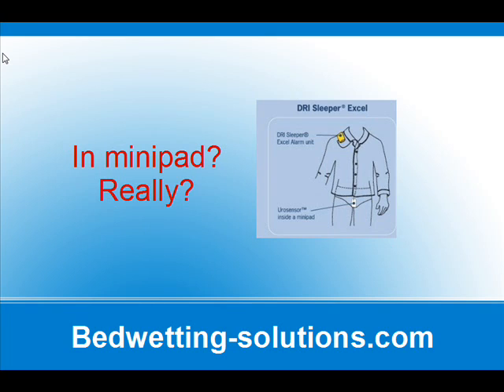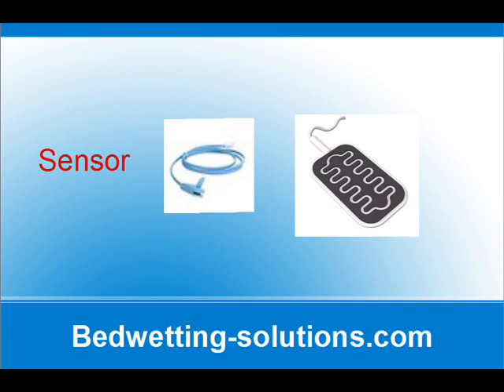The in-pants versions do seem to break down often. Go to the manufacturer's site to see if they sell replacement sensors. That's a rather bad sign, isn't it? Clip-on sensors can be placed properly to pick up just a few drops. They really are more effective.